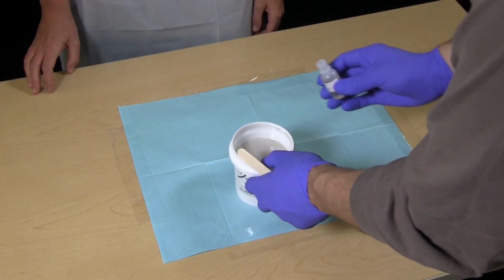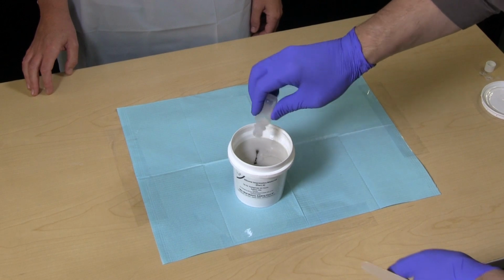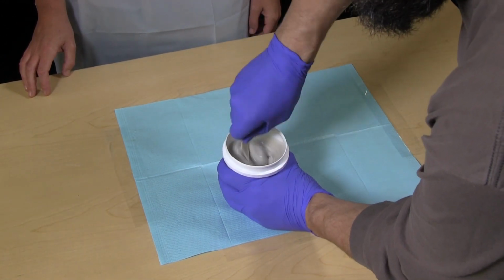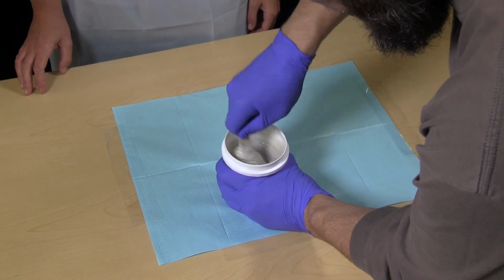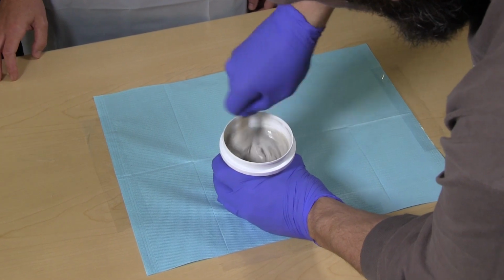Add 1 bottle of catalyst to 1 container of impression material and stir thoroughly. An uneven mix can result in uncured material. The work time is approximately 3 to 5 minutes. In warmer temperatures, this time will be reduced. Impression material must be refrigerated to increase work time.